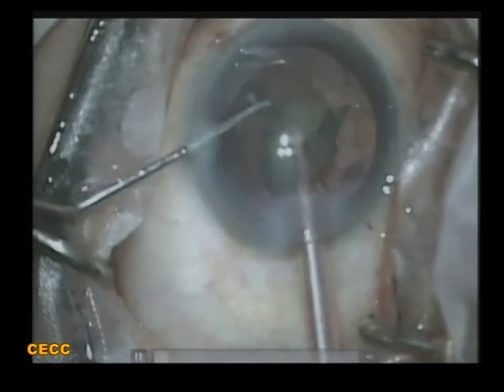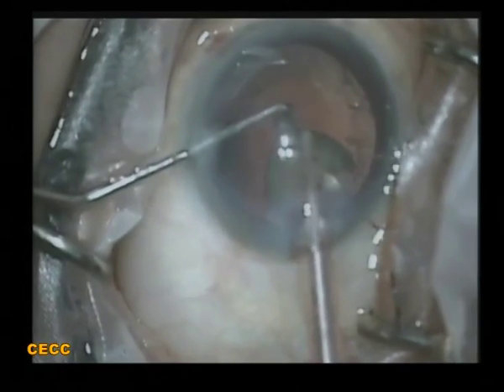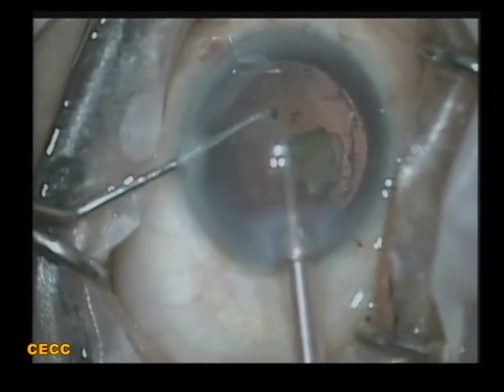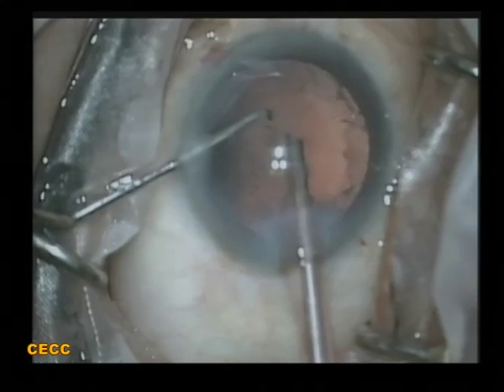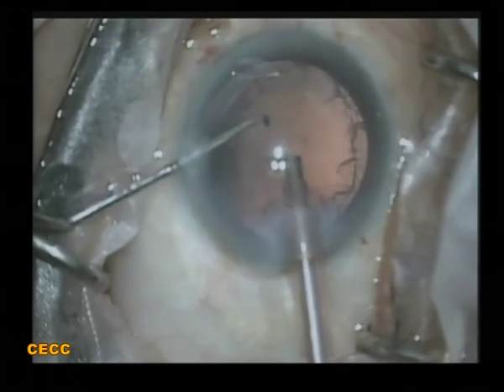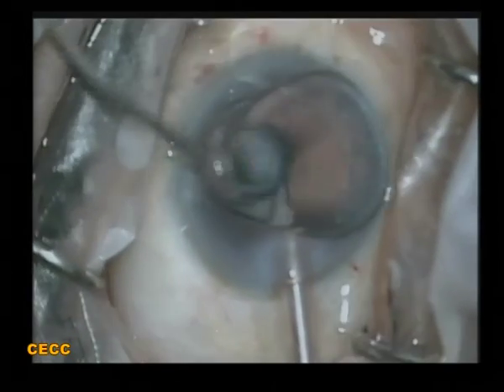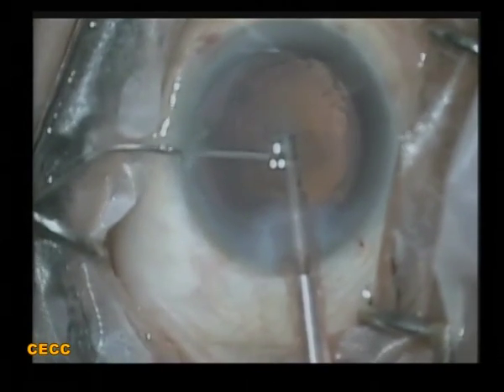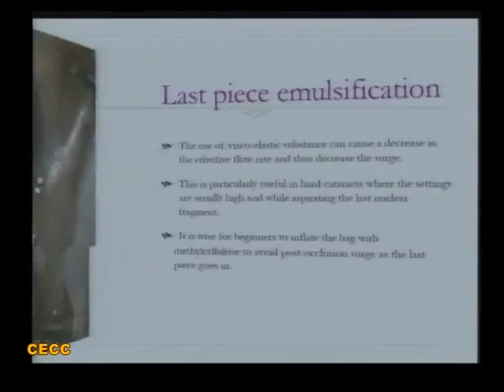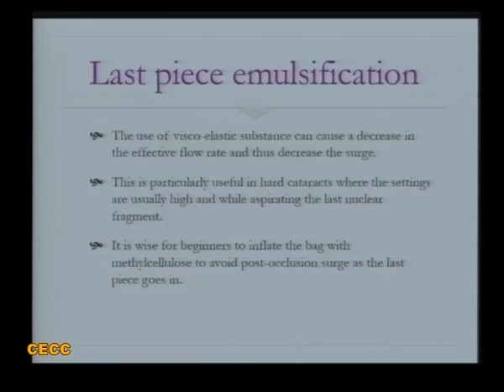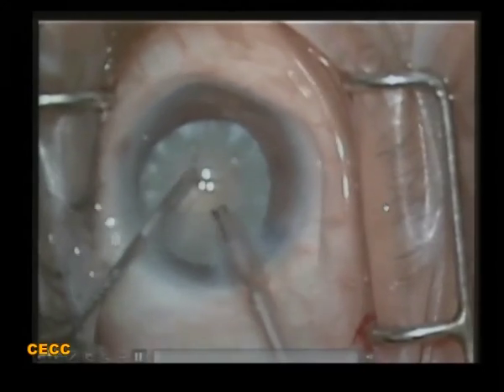In another white cataract case with hardly any cortical matter, I was on the last piece and almost asked to start opening the IOL. Suddenly the capsule came forward into the phaco tip. Thankfully I recognized it immediately, did not withdraw the probe, and injected some viscoelastic. I had to ultimately implant a multipiece IOL in the sulcus with posterior optic capture. For the last piece of phacoemulsification, it is important to use viscoelastic to your advantage — inject some viscoelastic underneath the nuclear material from the sideport, especially in hard cataracts where settings are high, as aspirating the last nuclear fragment can cause a sudden post-occlusion surge and posterior capsule rupture.